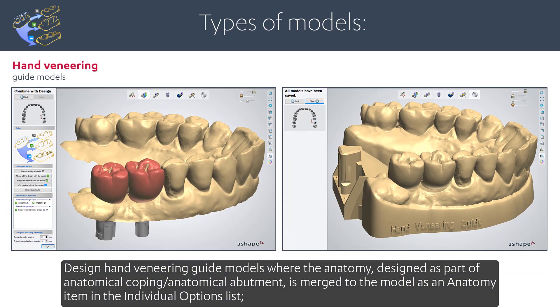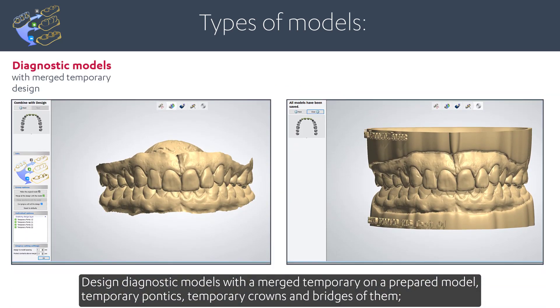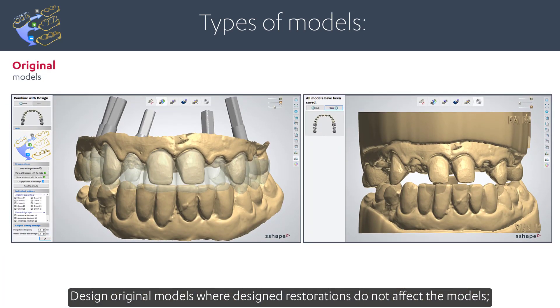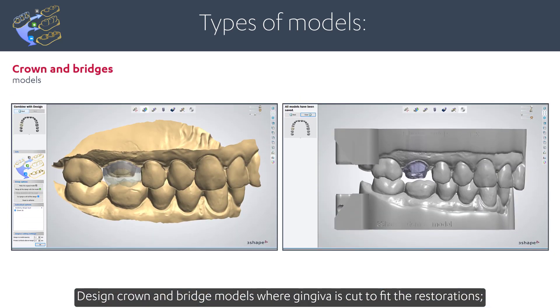You can design hand veneering guide models where the anatomy — designed as part of an anatomical coping or anatomical abutment — is merged to the model as an anatomy item. Design diagnostic models with merged temporaries on a prepared model, including temporary pontics, temporary crowns, and bridges. Design diagnostic models with merged restorations, design original models where designed restorations do not affect the models, and design crown and bridge models where gingiva is cut to fit the restorations.